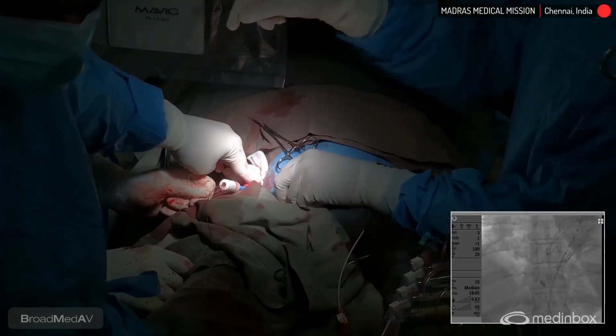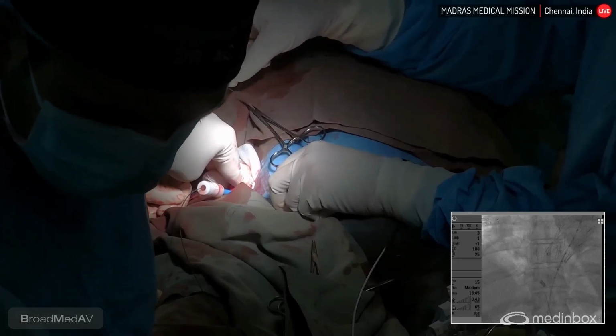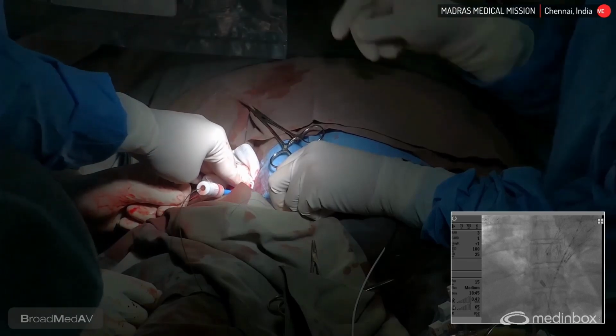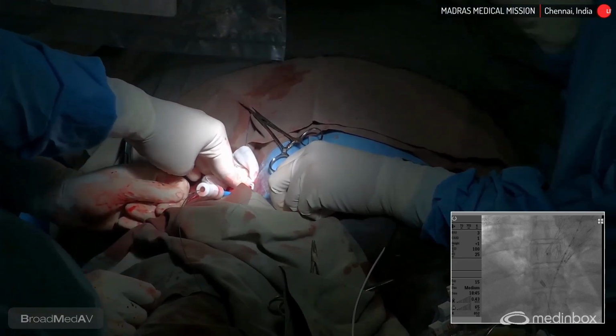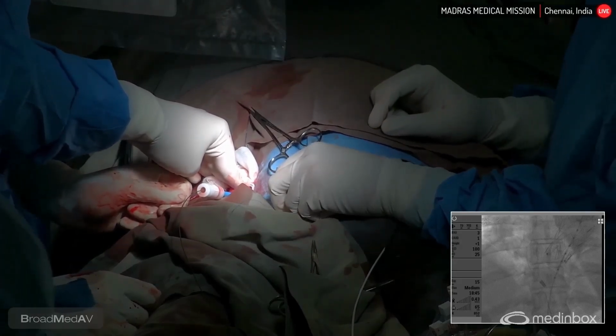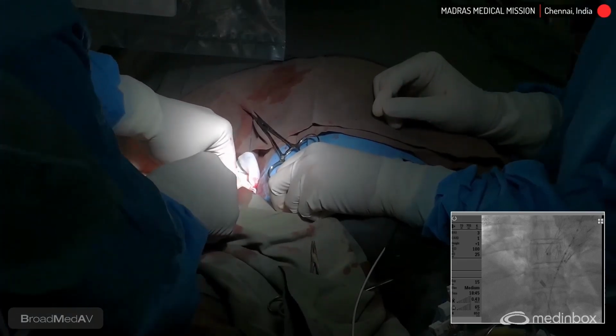The proglide has 2 suture threads. One is the blue one, the longer one, which is known as the rail suture, and the other, the white one, is known as the non-rail suture. The blue suture is used to push the knot, and the white one is used to lock the knot. Locking of the knot should be done lastly, before you are removing the sheath and wire.